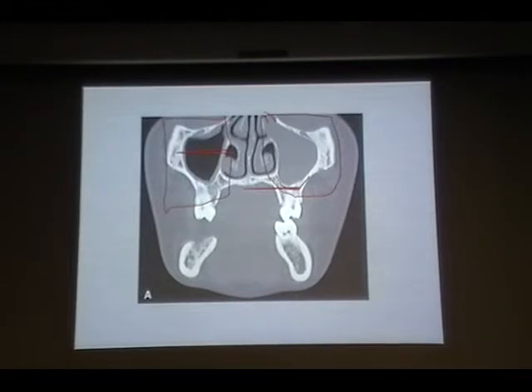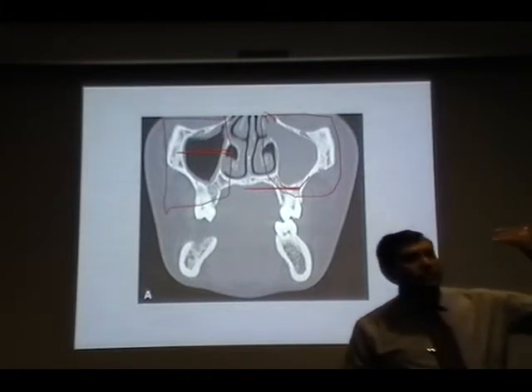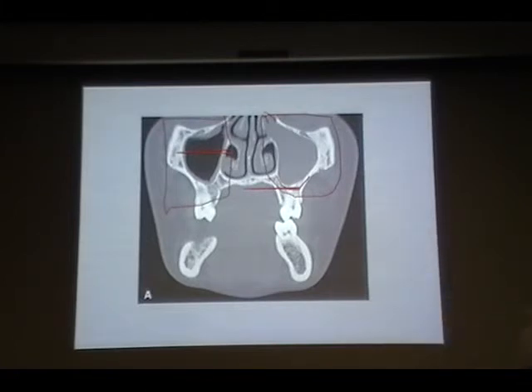From a different view, we'd be able to tell if, does inflammation move from the tooth side into the sinus? Yes. So that's one of the reasons that I'm telling you have to look at the volume completely. You cannot just say, looking at this slice, I'm confident that this is not a tooth-related problem. You have to look at the possible reasons that you could see, and how to differentiate tooth versus other.